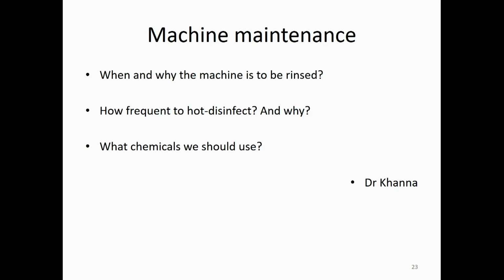If the previous day's bicarbonate solution is used the next morning, there is more infection, especially when the bicarbonate is high. In dialysis, they have seen more and more infection, especially when the pre-dialysis bicarbonate is more than 26 or 27.